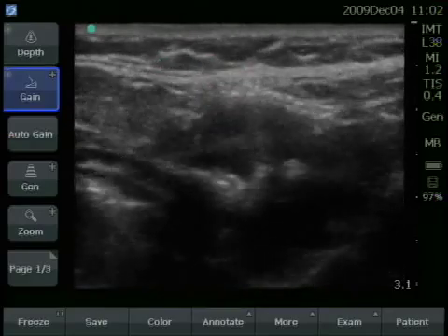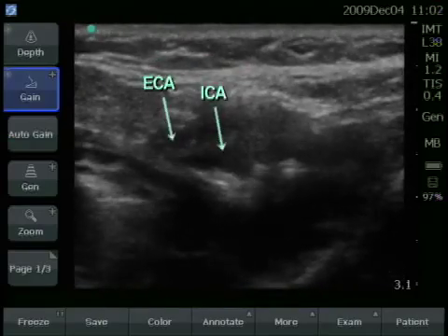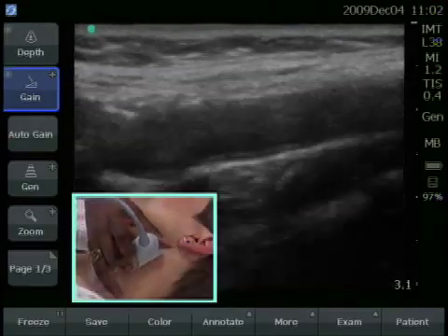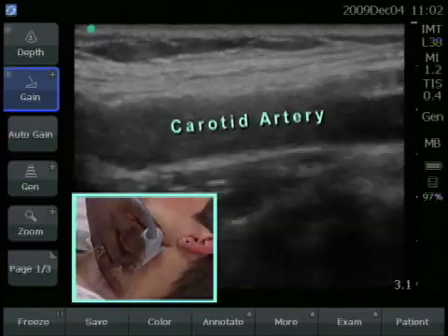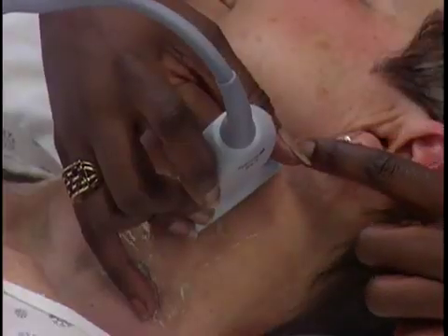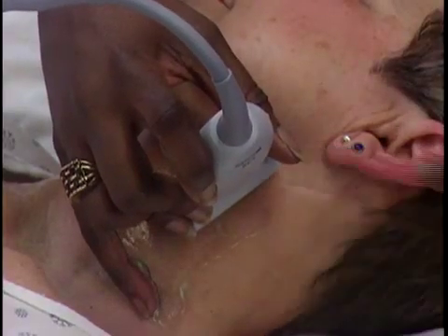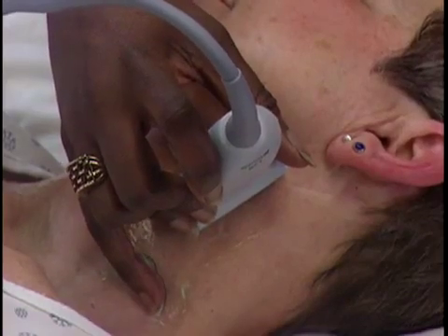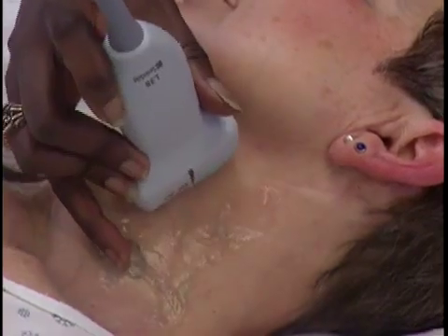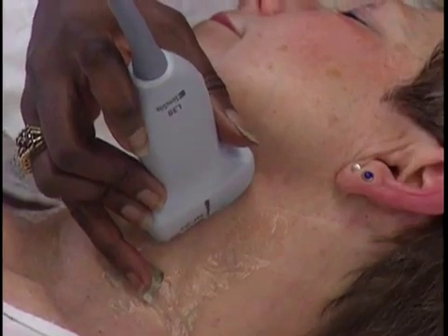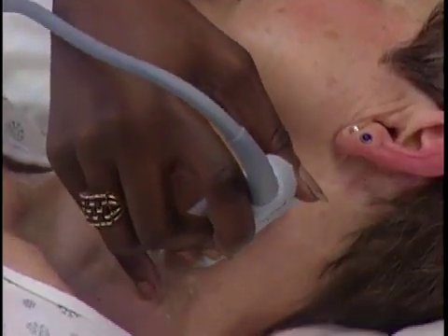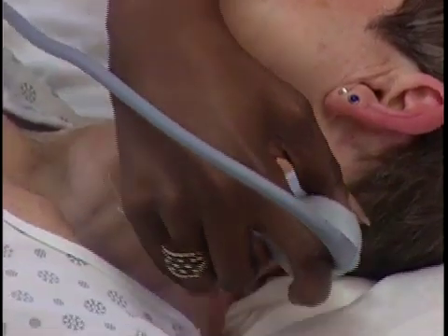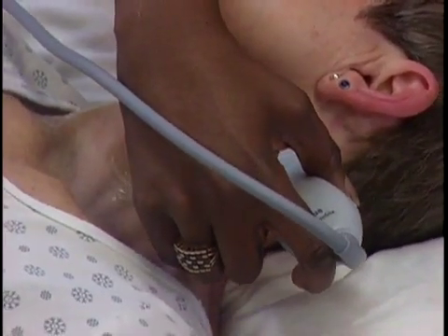Scan through the bifurcation of the internal and external carotid artery, and then turn the transducer to a longitudinal orientation with the orientation marker pointing toward the patient's head. On this side again, you want to come from three angles: from the anterior approach, roughly 2 o'clock; from the lateral approach, about 4 o'clock; and from a posterior approach, about 5 o'clock.